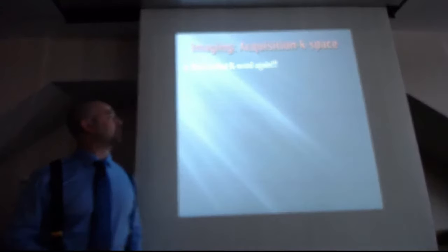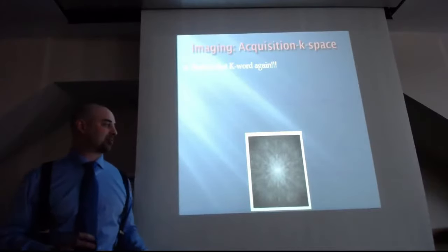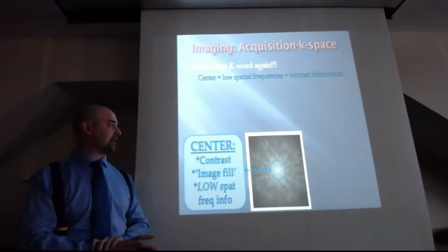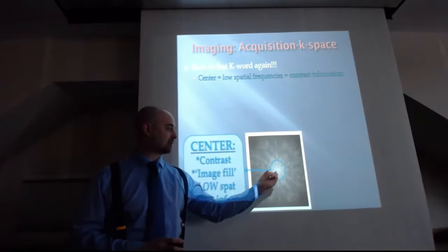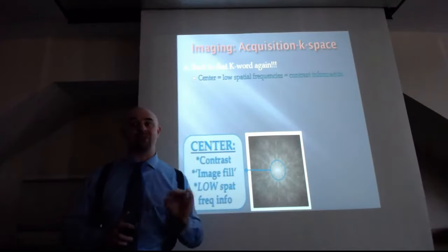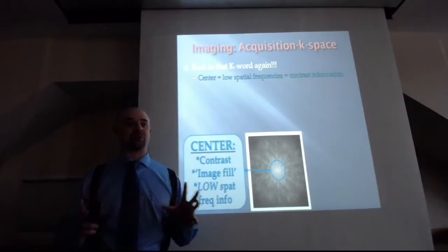Okay. Now, back to K-space. I keep throwing it in there. I know everyone hates it, but here's a picture of K-space. Remember, we talked about it before. K-space is not, or should not be, scary. It's just a plot. It's an XY plot, right? Smaller numbers in the middle, bigger numbers on the outside. Remember, K-space corresponds to spatial frequencies. So think back to our books on the bookshelf and what spatial frequency means.